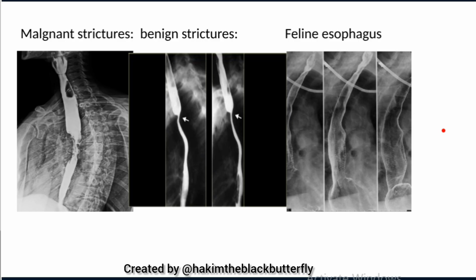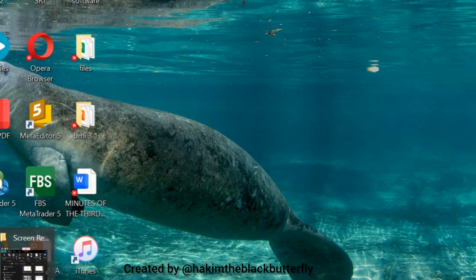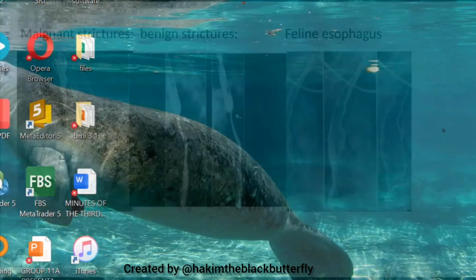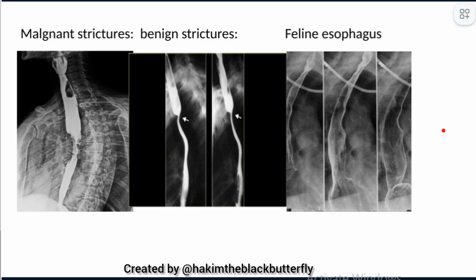you put holes within the straw, such that when the patient is sucking in the contrast with those holes within the straw, the patient sucks in the contrast with air, and that will give us a double contrasted image, as you can see here. So then I'm going to go to the indications.